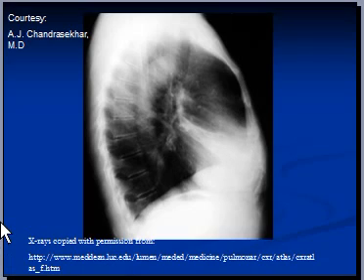The third important feature of a lung collapse or collapse of a lobe is the absence of air bronchogram, which you would normally comment on in a PA view rather than a lateral view.